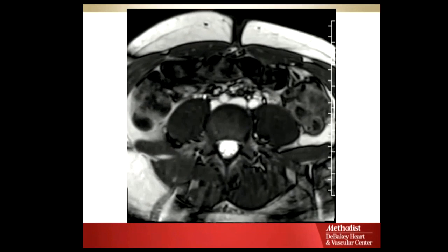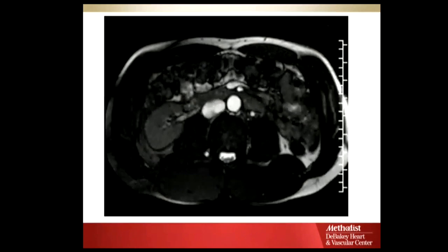Let me see here. Actually, I can't really tell here. Oh yeah, here. There you go. I wasn't sure what I was looking at. So this is actually the vein before they join and form the inferior vena cava. And you can see this time it's actually the right compressing. See how significant it is, right? You have also dilatation, and you have a bony structure. So this is the nice thing about having those dynamic imaging.